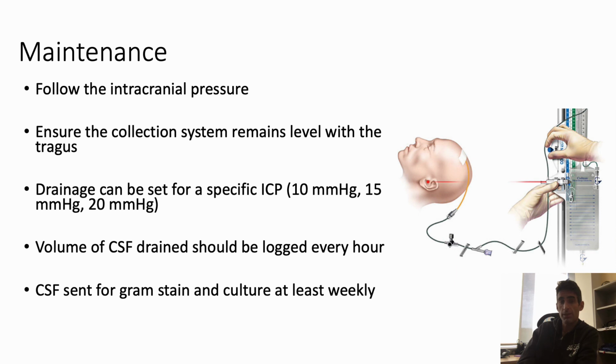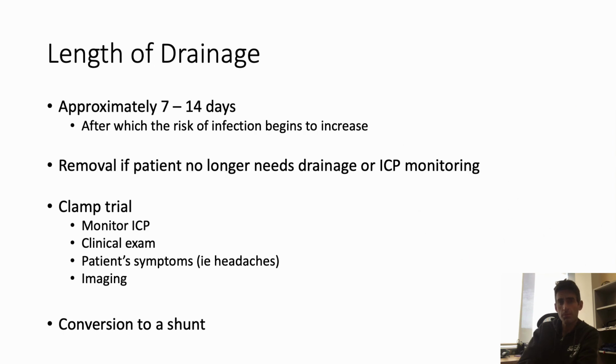Once it's in, we want to follow the intracranial pressure. We want to make sure that the collection system remains level with the ear. I think we have the lasers here to do that. We set the drainage for a specific pressure, and we should log the volume of CSF drained every hour. And at least once a week, I would send CSF to make sure that there's no infection brewing, via Gram stain and culture. I like to keep these in no more than 14 days. I think the longer you keep them in, the higher the risk of having a complication, whether it be infection, the patient pulling it out, etc. And then you want to remove it, or you want to put a shunt in.